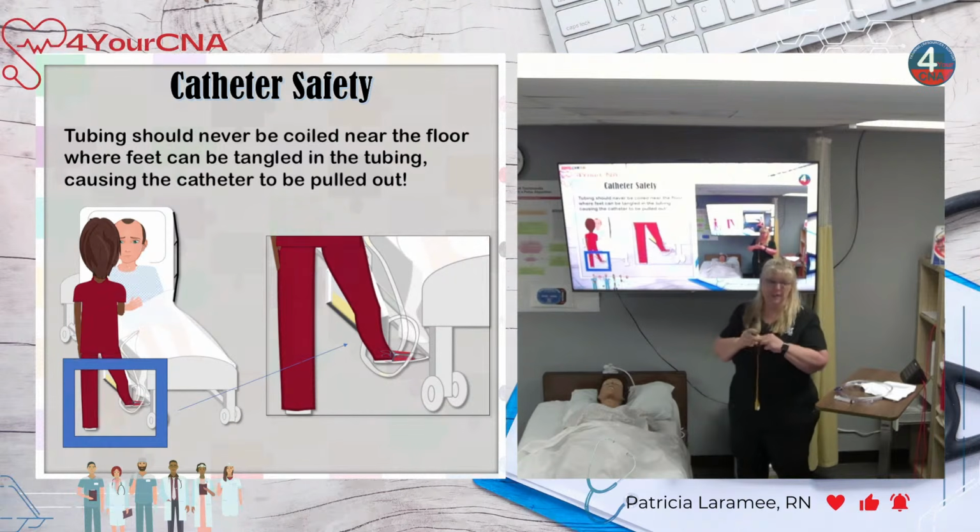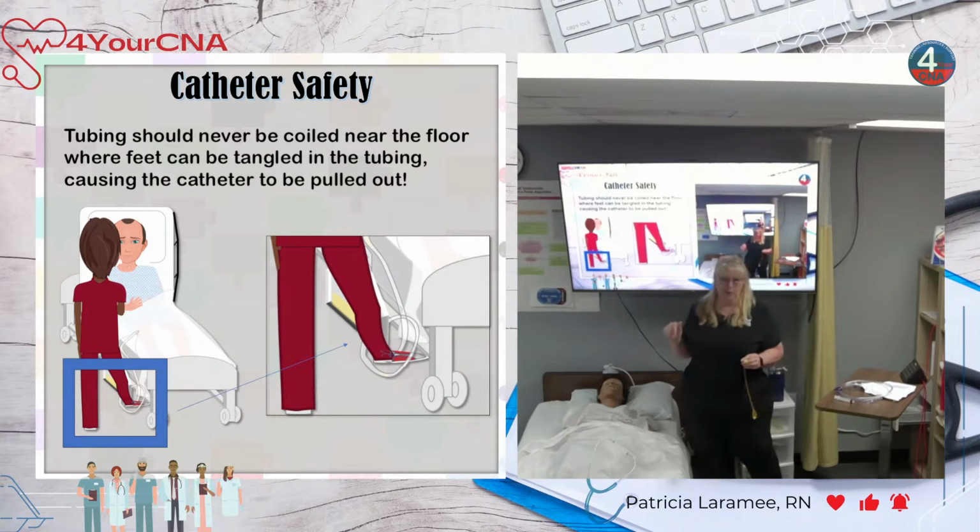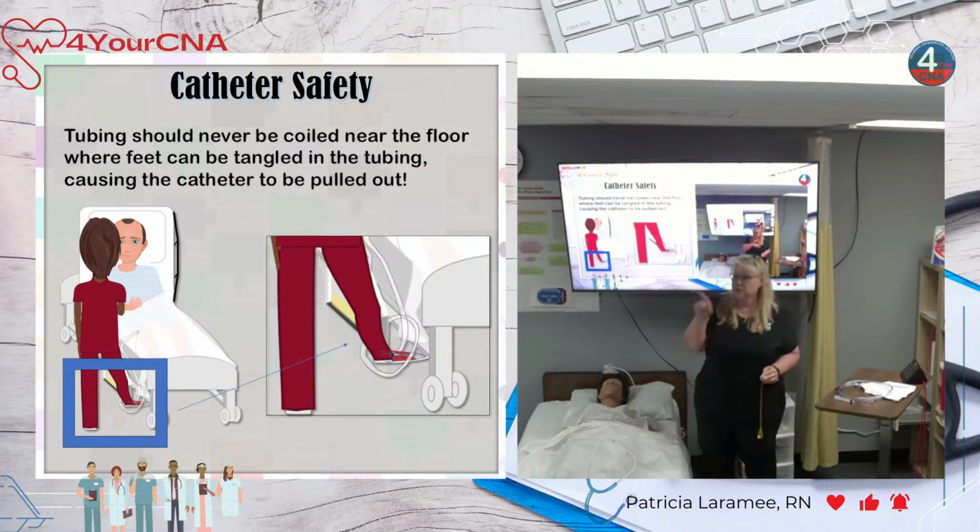That's peeing razor blades. And it's going to take days for that to subside. Now, the real problem here, that's pretty bad though, isn't it? That's not even the real problem. The real problem is anytime that there is injury, there's swelling. Probably not a place we want swelling, guys. If I have to put another catheter in and the area is swollen, I may not have that opportunity. So I've only got about 45 minutes before the swelling is so severe that I won't get another catheter in.